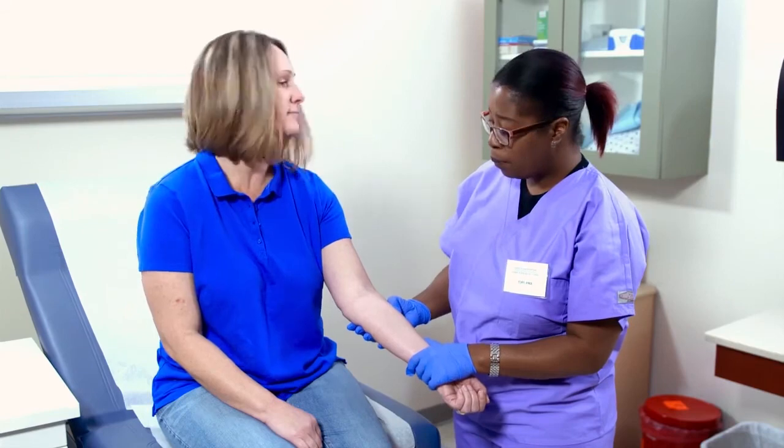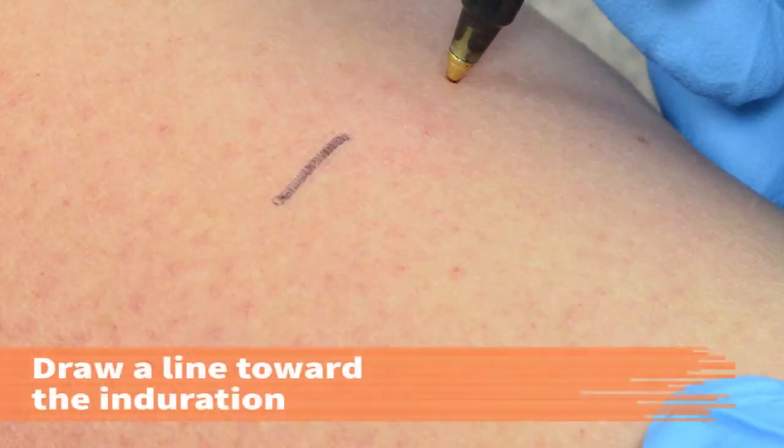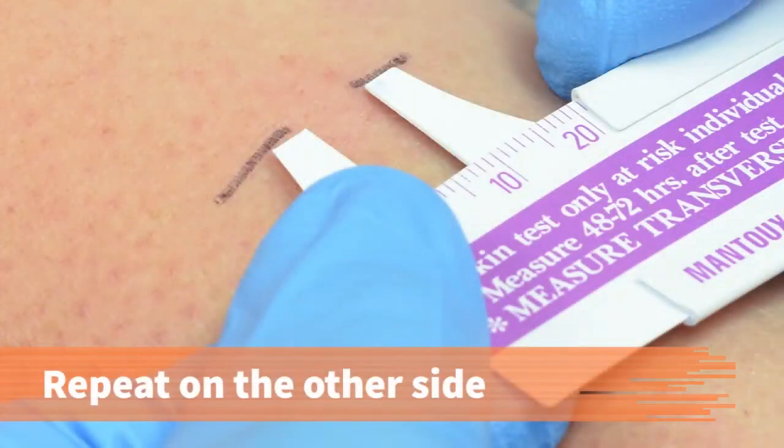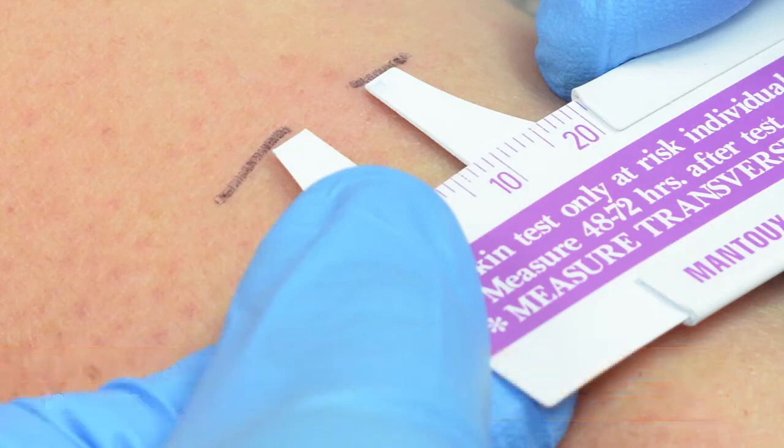Okay. If an induration is felt, ask the patient if you can write on her arm. Using a ballpoint pen, draw a line towards the induration from the outer edge of the arm. Repeat on the other side. With a disposable millimeter ruler, accurately measure the distance between the 2 points.